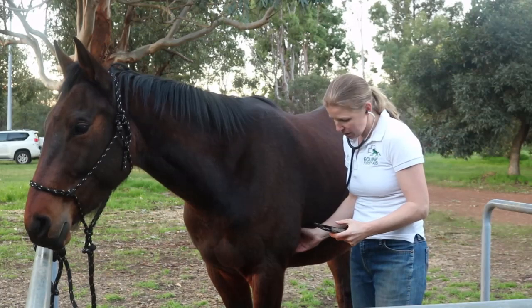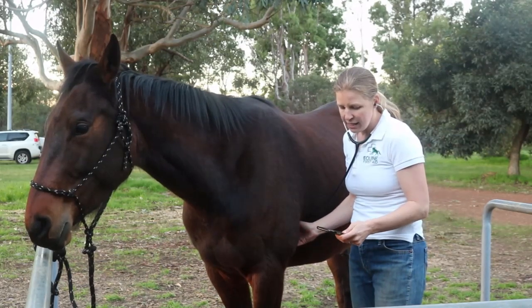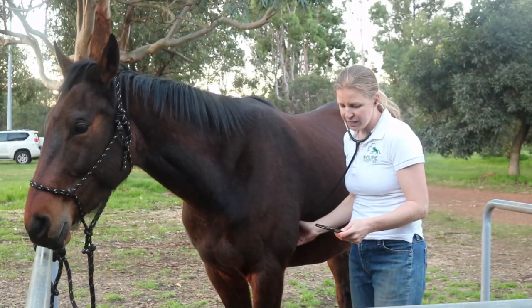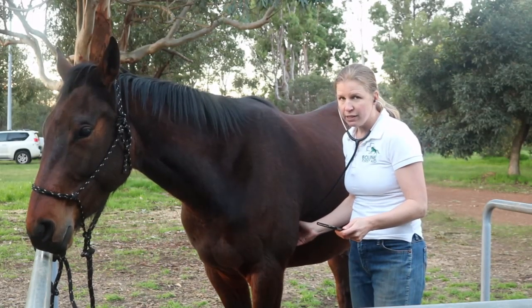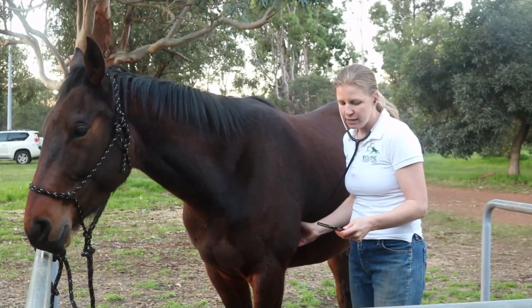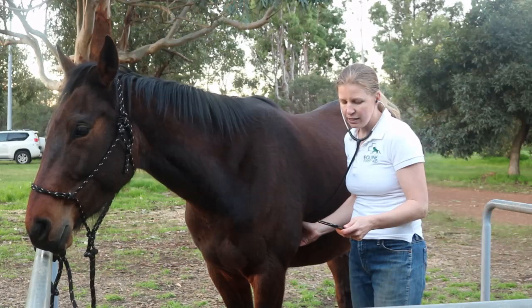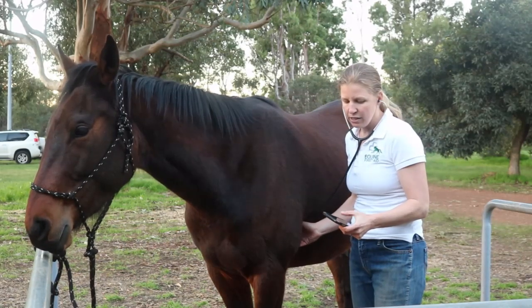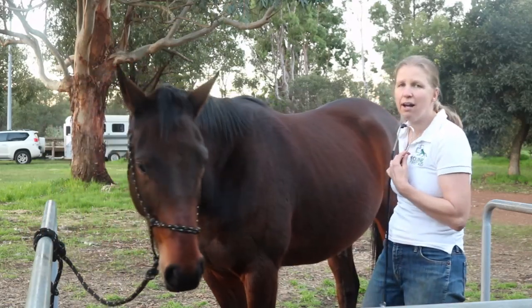To take his heart rate, I've got my phone here. Once I'm in the right place and hearing it well, I press start and count for 15 seconds — four, five, six, seven, eight, nine, ten. That was 10 beats over 15 seconds.